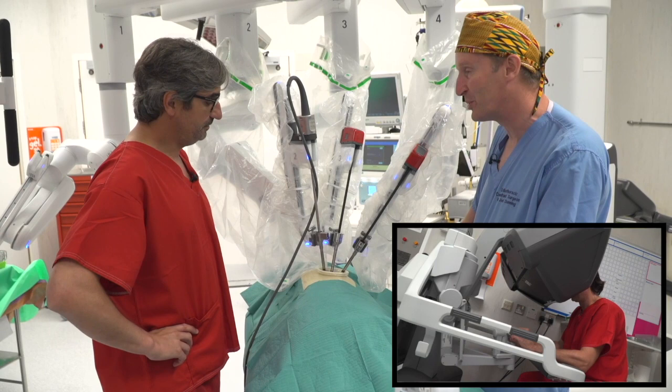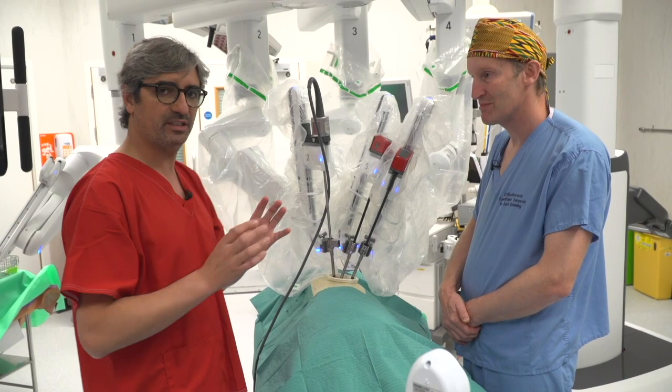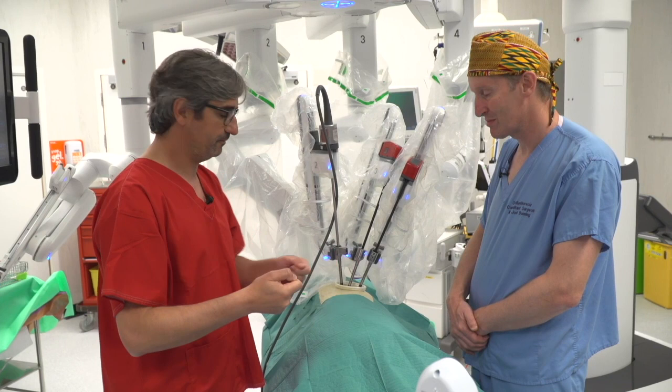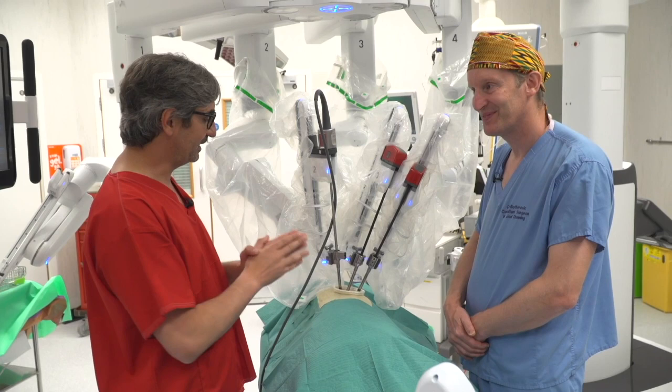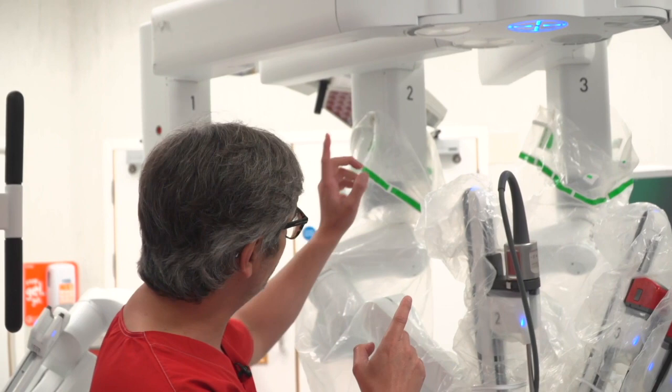Well, when we use Uniportal RATS, the most important thing is that we need to know how to set up the arms. It's crucial. If we don't have good movements here, the surgeon at the console is completely limited, cannot move forward. On the right side, after thinking a lot and trying all possibilities, we designed the best configuration: cancel arm one. So on the right side, arm one should be out, and then we use arms two, three, and four. Three arms through the incision.